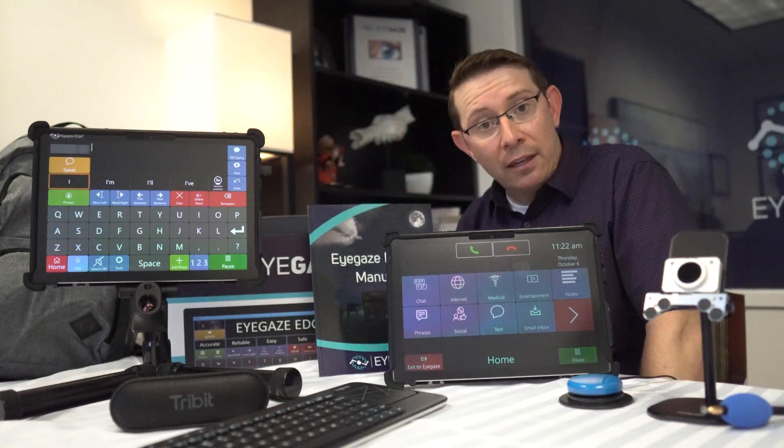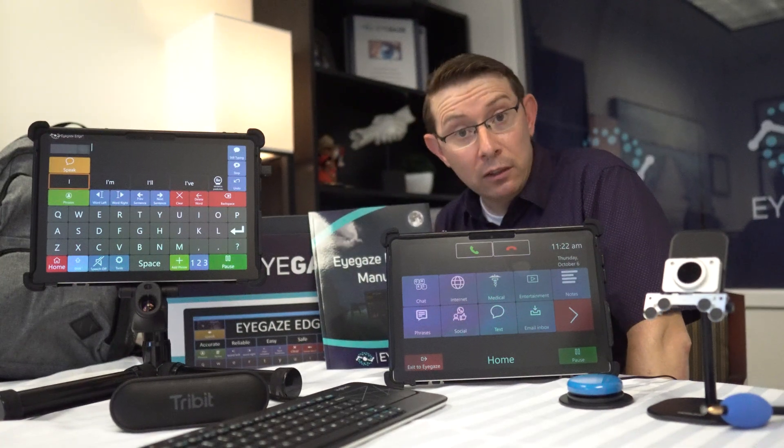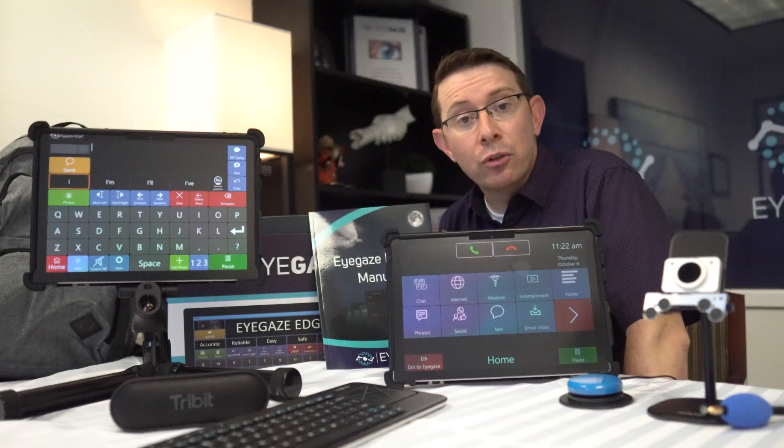Every iGaze Edge has on it a suite of training videos and software that allows us to remotely give you tech support from wherever you are in the world.